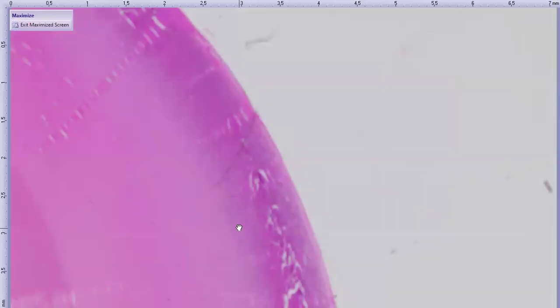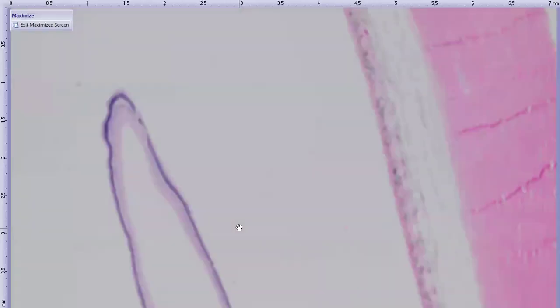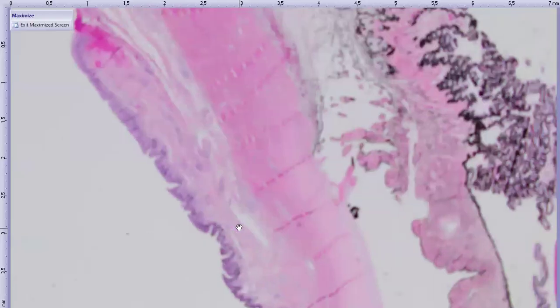To compare in terms of aqueous outflow for horses, we do have that orbital tumor horse here, which had much more of a normal, well-formed angle. We're going to orient it the same way for consistency. Wait, this way. I am really used to having the cornea a certain way.